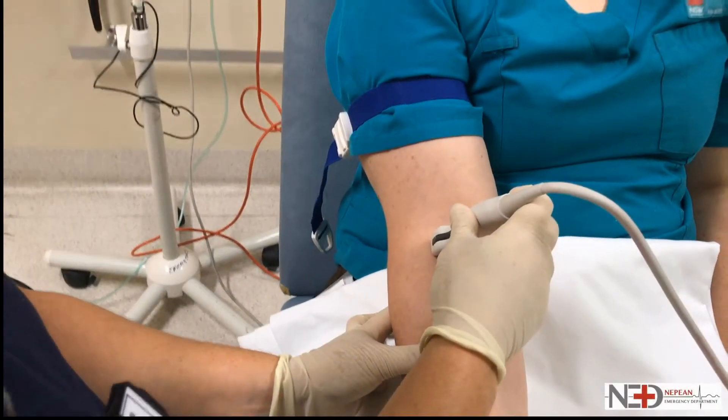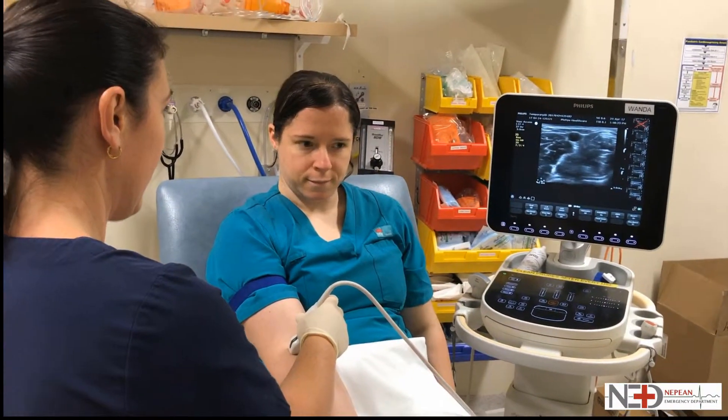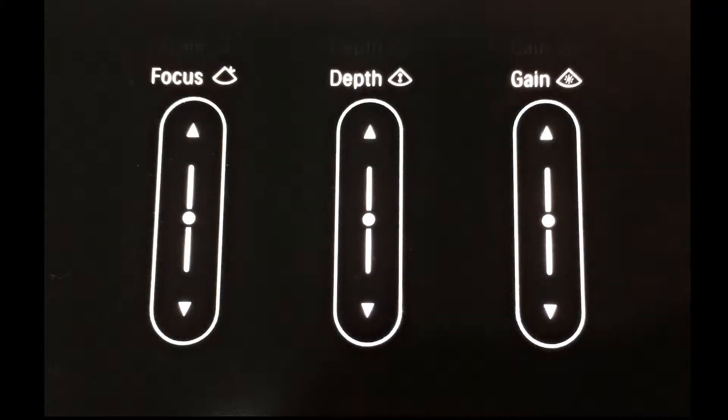Personally I also have a 3ml syringe with some local anaesthetic to instill before I put the cannula in. Look before you leap — have a quick look for the best vein before putting on the sterile probe cover. This is the opportunity to make all necessary adjustments to the ultrasound machine such as depth, focus and gain.